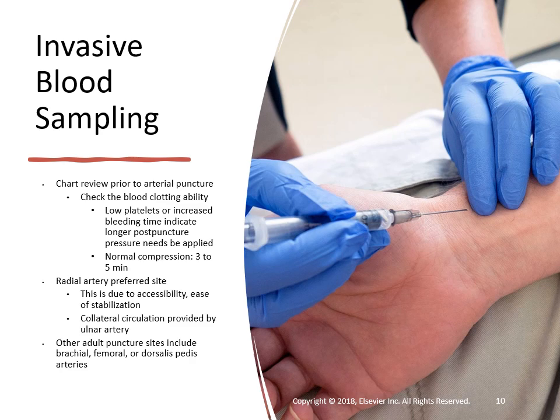Fine points involved in arterial puncture include checking coagulation-related tests, assessing for collateral circulation before and after the procedure, and proper technique to minimize pain and complications.